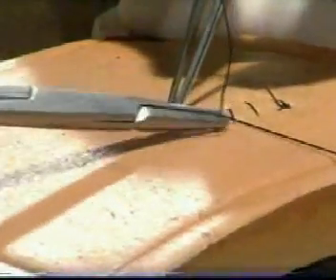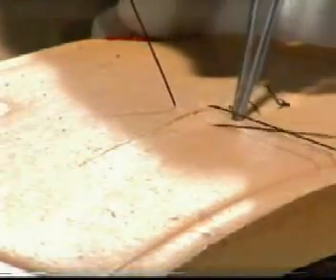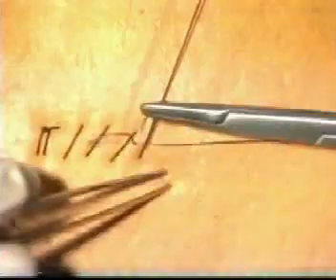Work along the wound ensuring equal distance between the sutures to ensure the same tension down the whole length of the incision.